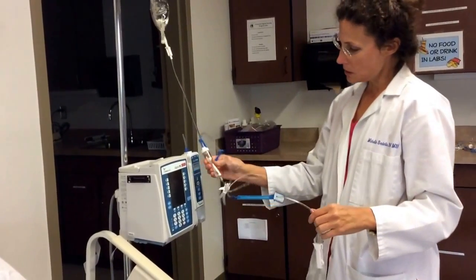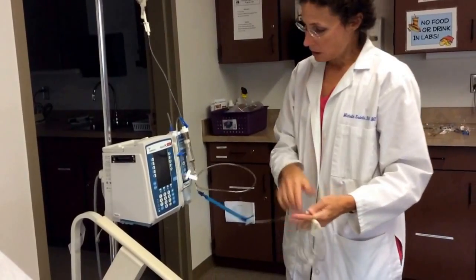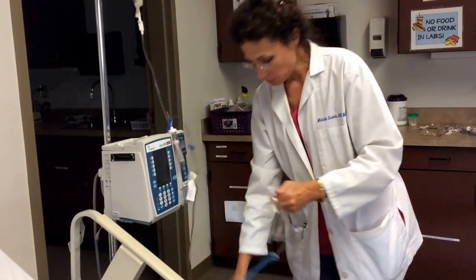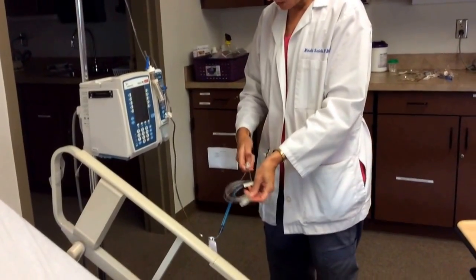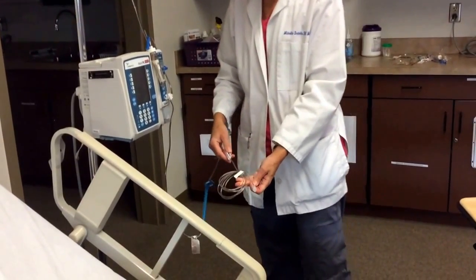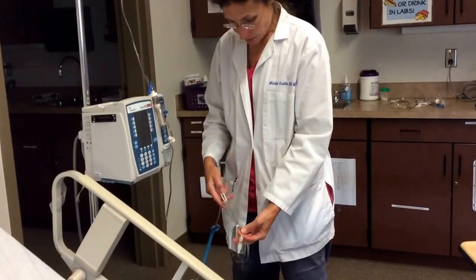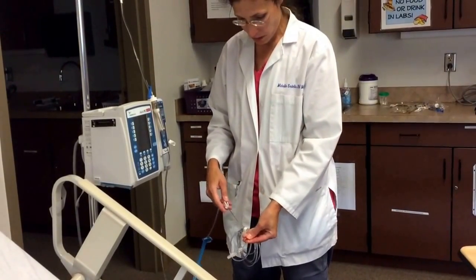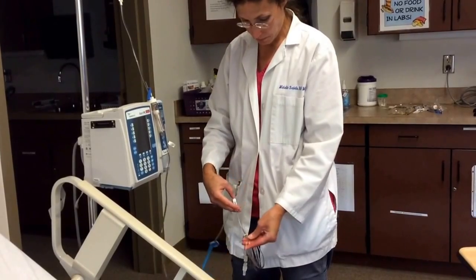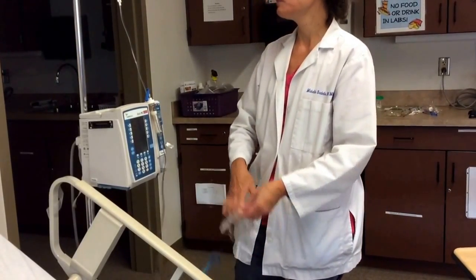So I'm just getting some saline down into my chamber. And now I'm going to open and just prime this tubing through with saline. And if I lose a little bit as I'm priming, that's okay. This is just a flush bag. I won't use the whole bag of saline. Okay, good. So the tubing is primed.